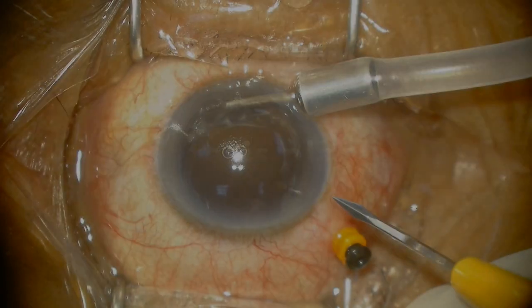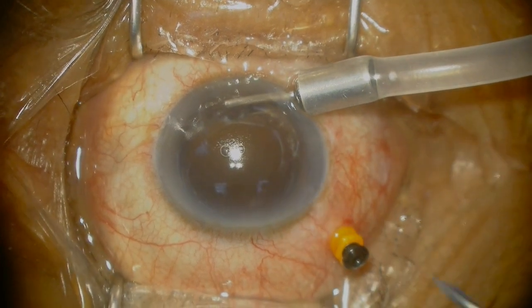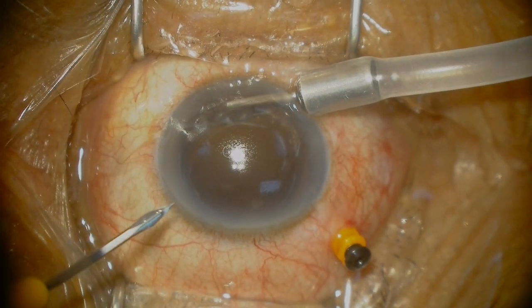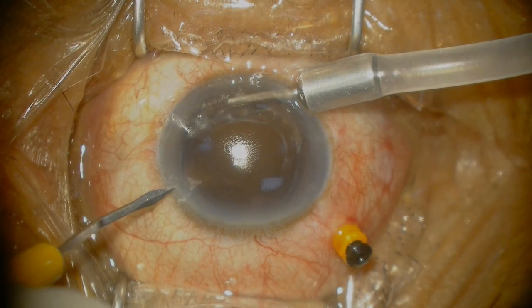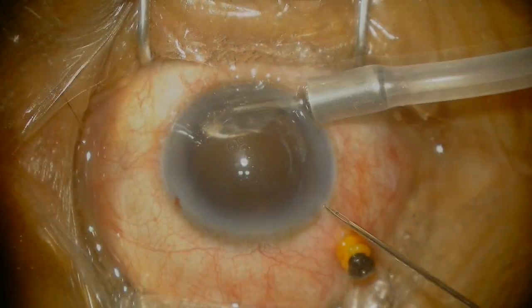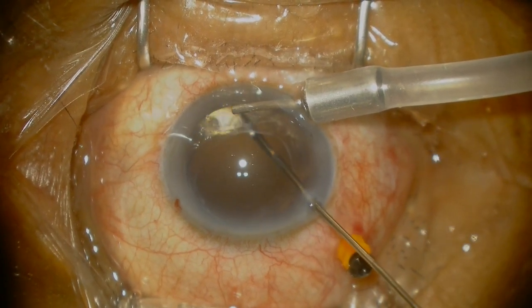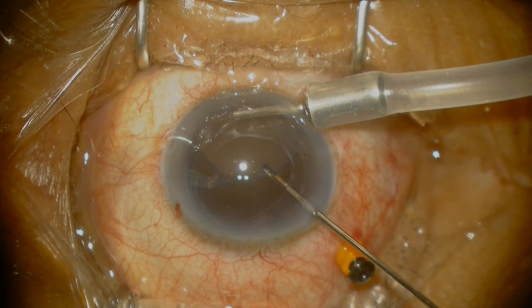Paracentesis placements are always important. Sitting superiorly, which is my preferred position, I tend to put them at about 10 and 2 o'clock. In tight Asian palpebral fissures, I find that the nasal and temporal areas allow me more space to pass my needles rather than when I sit temporally — they can be quite tight sometimes.